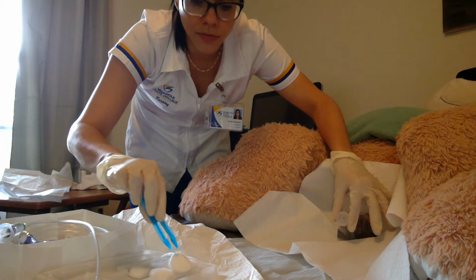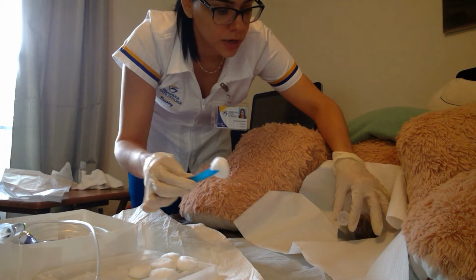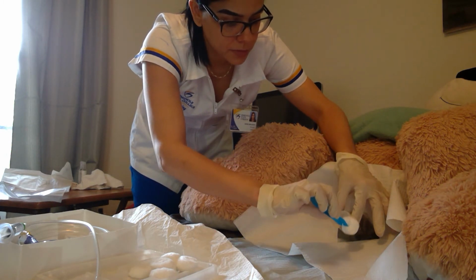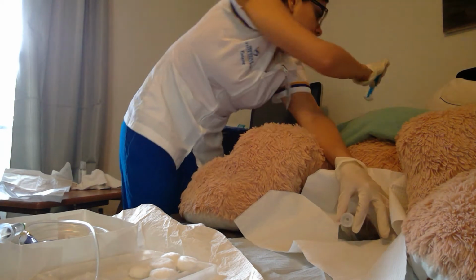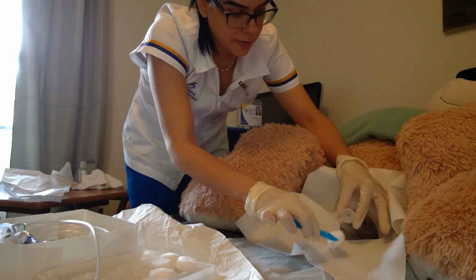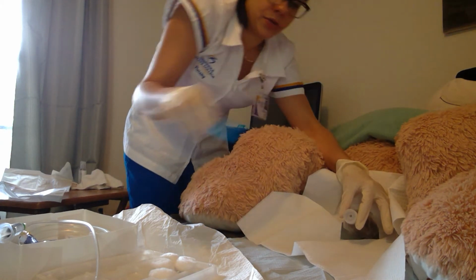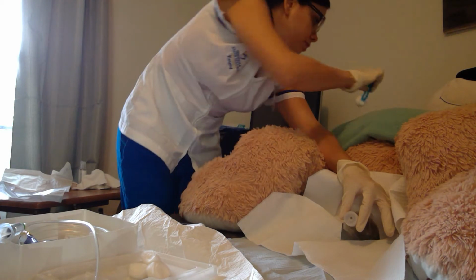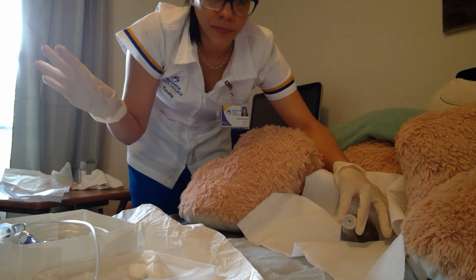I am going to use my forceps, one cotton ball, and I'm going to go one side of the labia, top to bottom. That is dirty. I'm going to use another one on the other side, top to bottom. That is dirty. And then I'm going to use one more for the center. That's all dirty. All right.